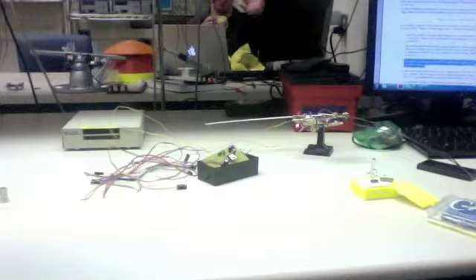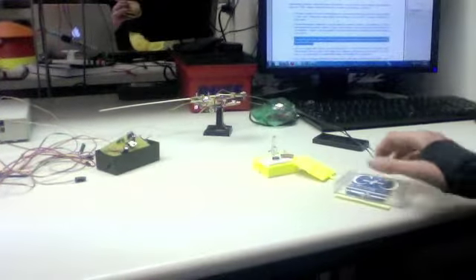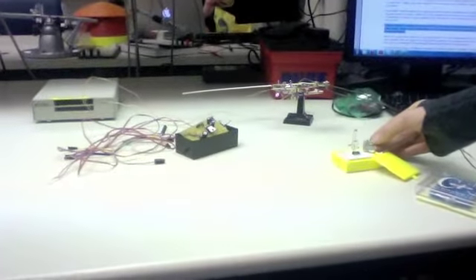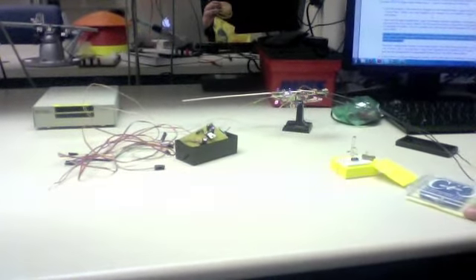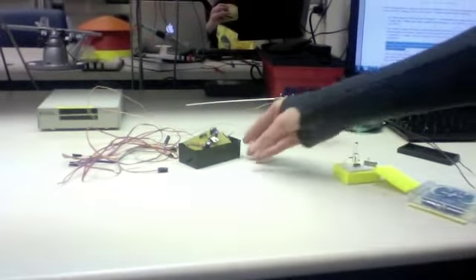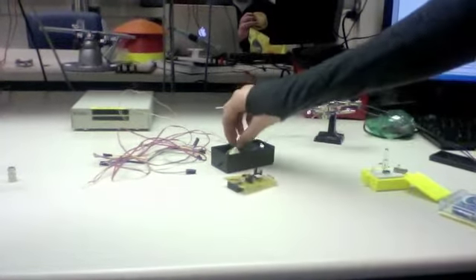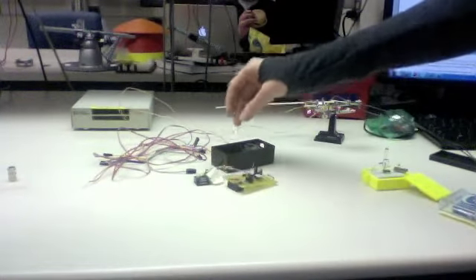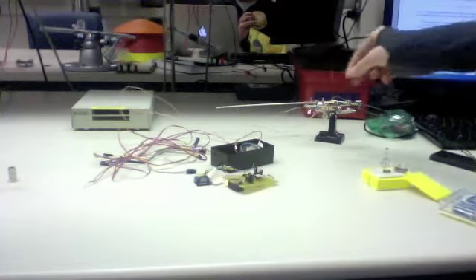The box in the brain consists of a neural electrode which will read neural activity, a thermistor which will tell how cold the brain is, and a filtering circuit which will filter the input from the neural electrode. In the body box, we have a PCB which will control all of the signals, the ATtiny which will control the PCB, and a battery pack which will power the entire thing.